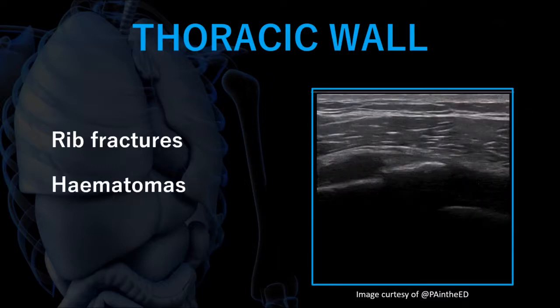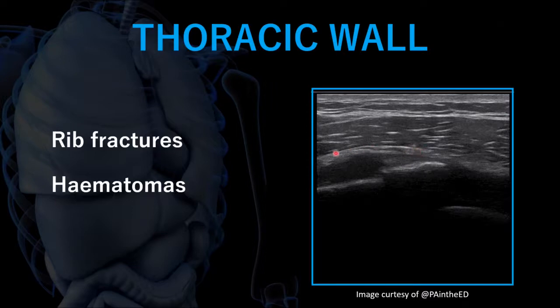When you do have rib fractures, you can also identify hematomas associated with those fractures. In this image, we have one part of the rib, the fracture line, and then the other part. This dark area just underneath the subcutaneous tissue and connective tissue layers is a dark hematoma underneath. You can track the size of those, making sure they're not getting worse and hopefully that they are resolving.